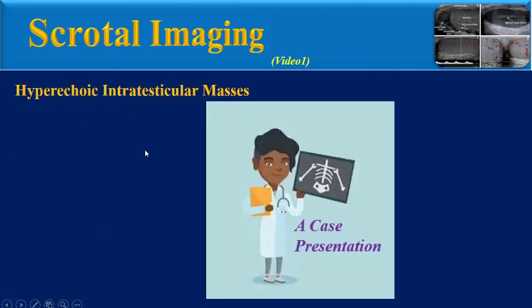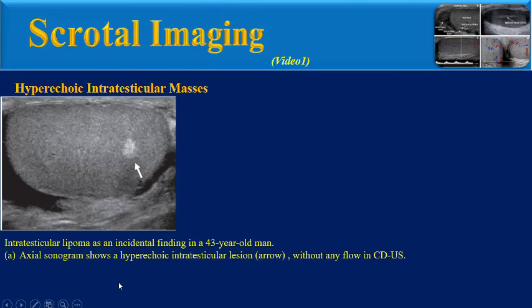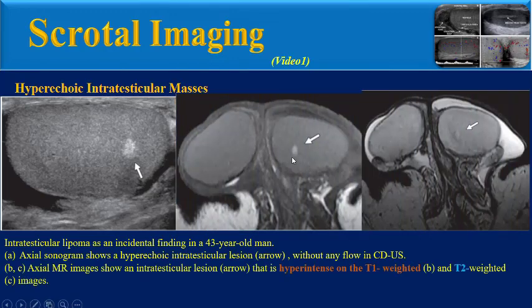Here is another teaching case presentation. This image shows an intratesticular lipoma as an incidental finding in a 43-year-old man. Axial sonography shows a hyperechoic intratesticular lesion without any flow on color Doppler ultrasound. On MR imaging, it shows high signal intensity on T1 and T2, which is consistent with subcutaneous fat signal intensity.